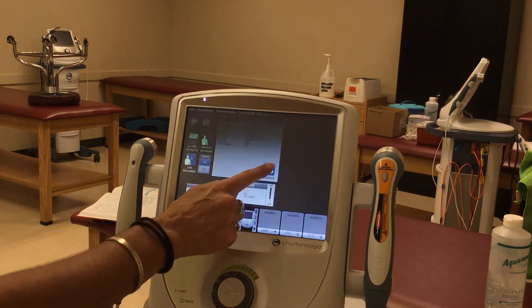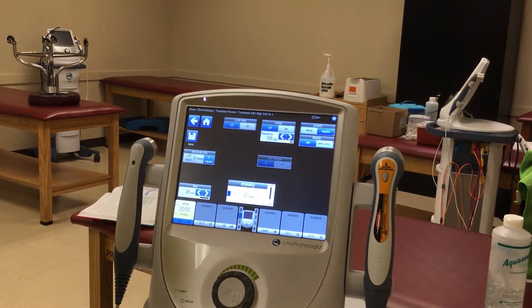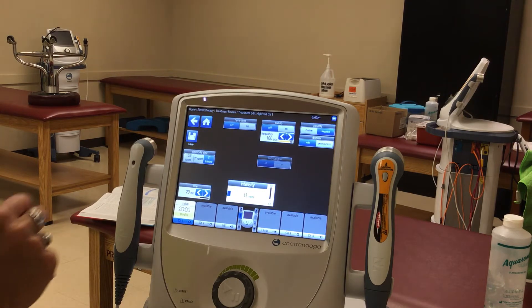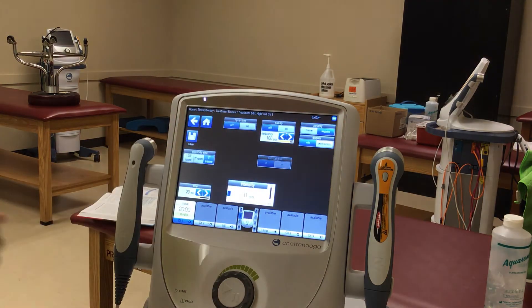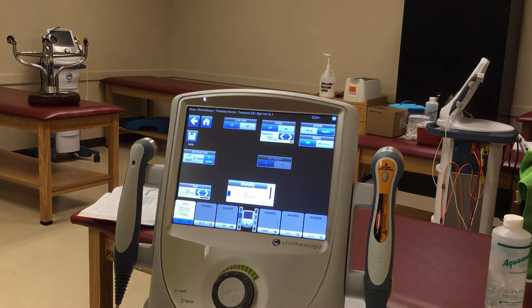We're going to go to customize, and we're going to change it to the two-inch squares — even though they're going to be rectangles. When we look at these settings, if it's a brand new injury, one of the things you really want to focus on first is using negative polarity, because this helps with breaking up clots and helping with the inflammatory process kicking in.